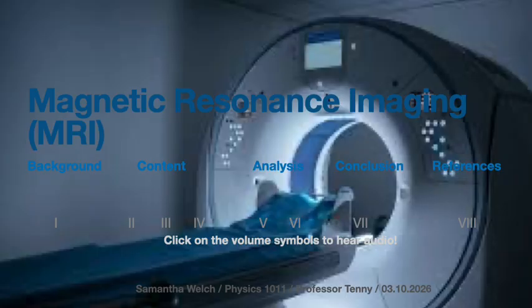When a patient enters the MRI scanner, they are placed inside a very strong magnetic field. This field typically measures between 1.5 and 3 Tesla. To compare, the Earth's magnetic field is thousands of times weaker. Inside the MRI machine, in the strong magnetic field, hydrogen nuclei begin to align either with or against the magnetic field.